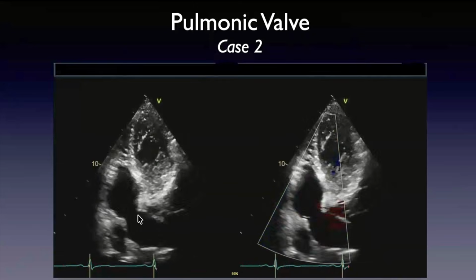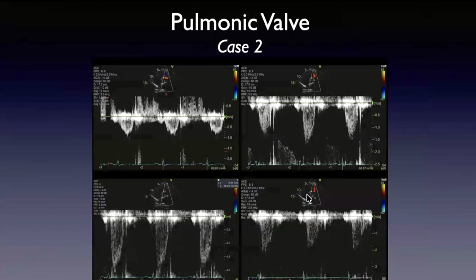but you can see a bit of the waist. And in this case, kind of to Tom's point, when we use pulse wave Doppler to interrogate, here's the RVOT, here's through the pulmonic valve, here's just above the pulmonic valve where that ridge was, and here's even more superior to that. So here, the flow acceleration is highest where that ridge is. So this is supravalvular. This is mild supravalvular pulmonic stenosis.